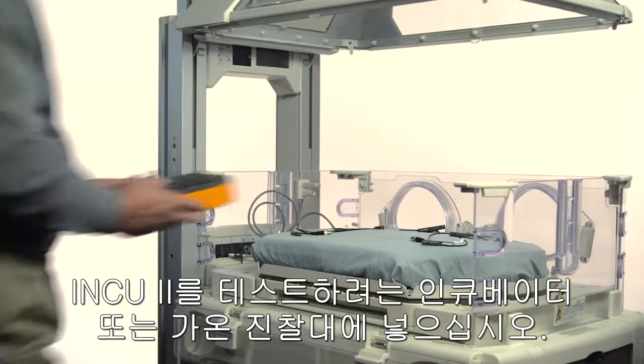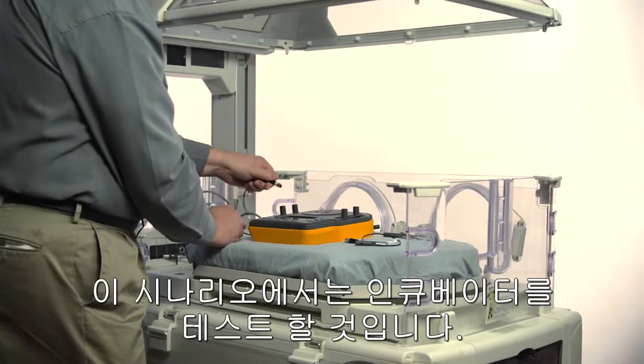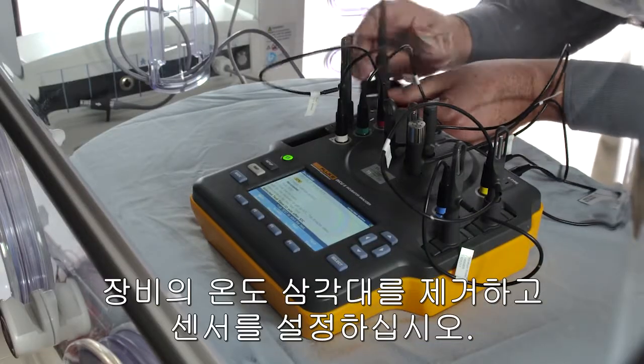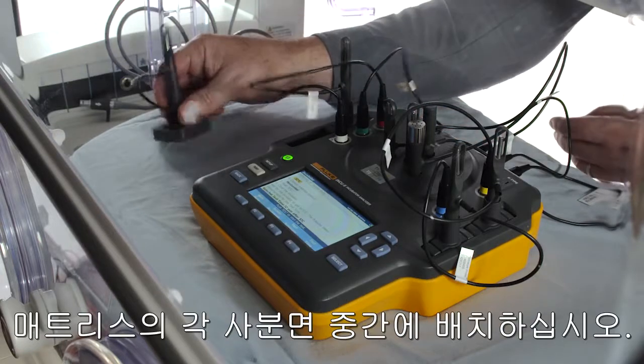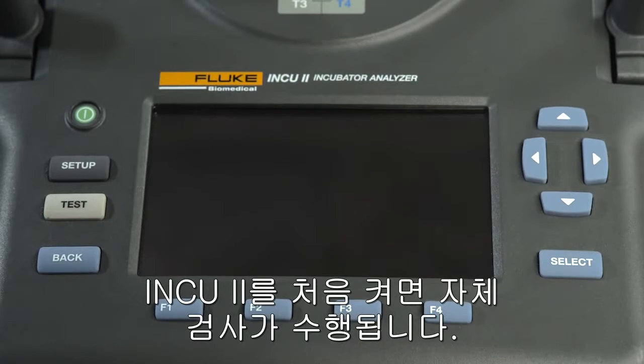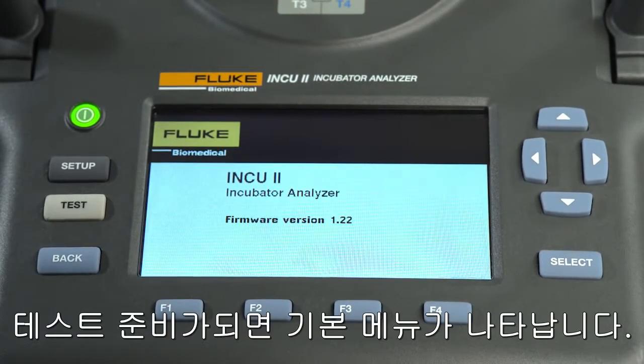To start, place the INQ-2 in the incubator or radiant warmer you're testing. In this scenario, we're going to test an incubator. Remove and set up the temperature tripods and sensors, and position them in the middle of each quadrant of the mattress. When you first turn on the INQ-2, it will do a self-check. When it's ready to test, the main menu will appear.